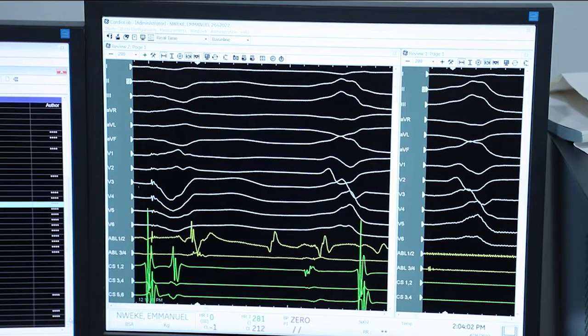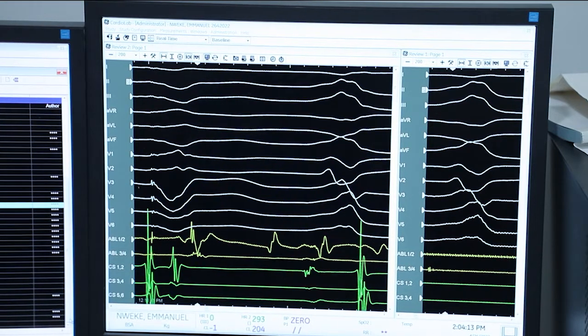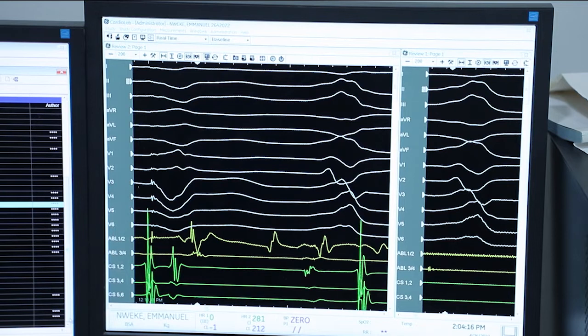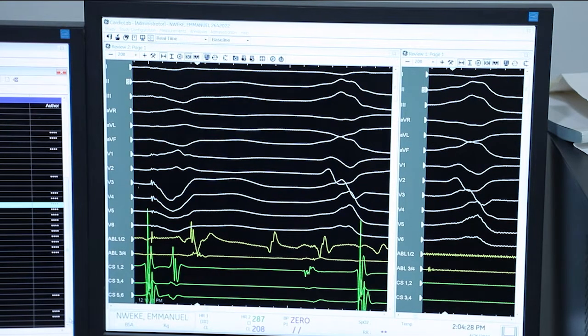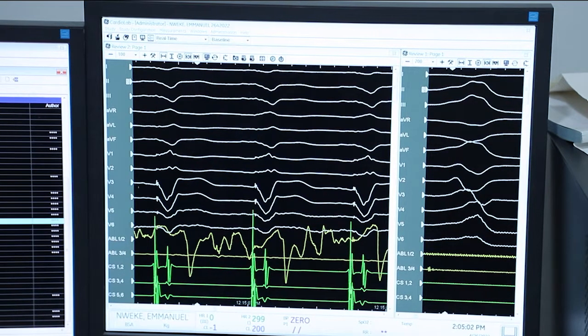Then our strategy was to ablate the basal anterior wall corresponding to the endocardial side of the LV summit, ablation from the left coronary cusp, and again ablation inside the great cardiac vein. So these are the 3 sites we ablated from. After ablation from such points, we could definitely eliminate the PVCs totally with no recurrence of PVCs. Okay, thank you.